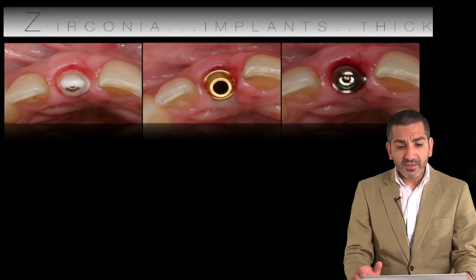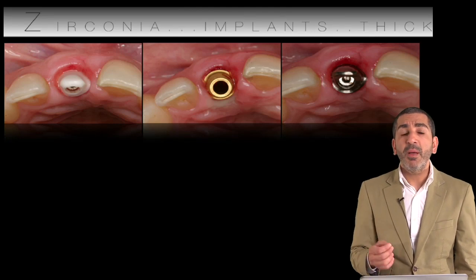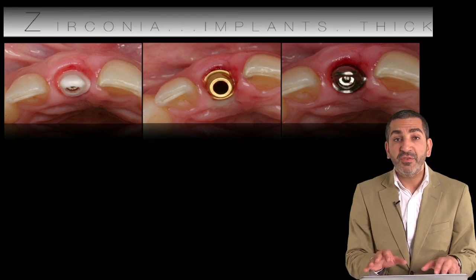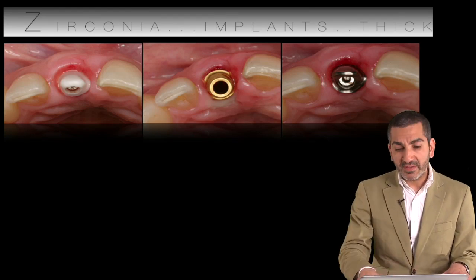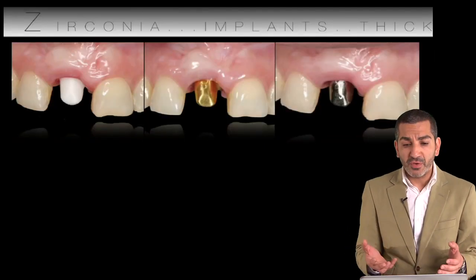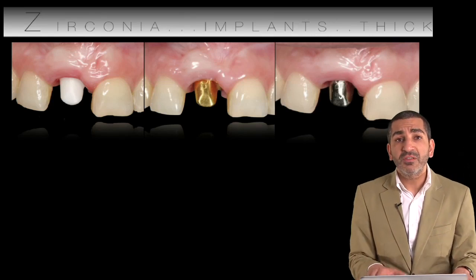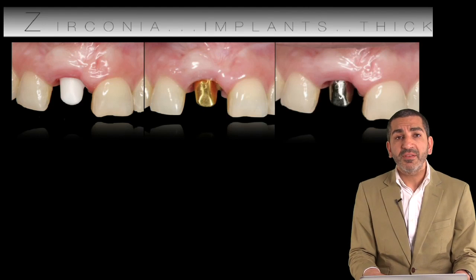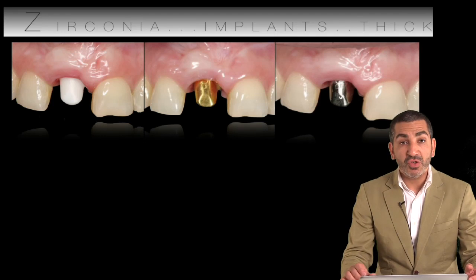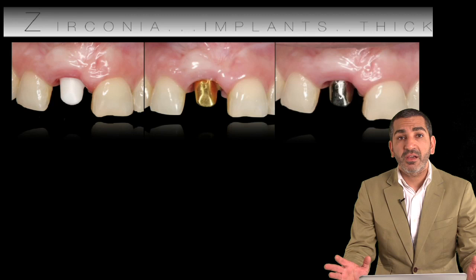In this particular instance, in order to test to see what material and what abutment will be best for this patient, we decided to use 3 different abutments. And we looked at these abutments from different views, from the occlusal and the facial view. And once you take a look at the soft tissues, what is it that you can see? You can simply see that really the abutments don't play any influence. They have no influence over the soft tissues. And why is that? Because really, the soft tissues are thick.